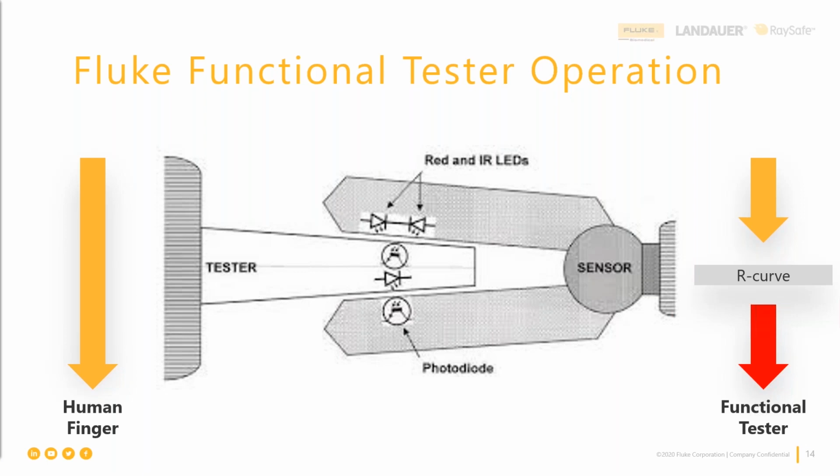It'll measure the amount of light, decide which type of light it is, red or infrared, and calculate for the test settings how much of that light would be shining all the way through an actual finger. It'll turn on its own LED on the bottom so that it looks like it's shining through the finger with that exact amount of light. This LED has a wide enough bandwidth of light to be detected by the monitor, and there only needs to be one light detector in the monitor because it can detect either wavelength, and the monitor itself should know which wavelength it's outputting at any given time.